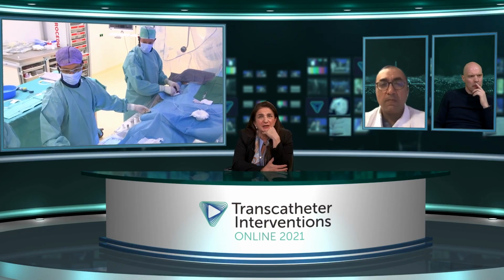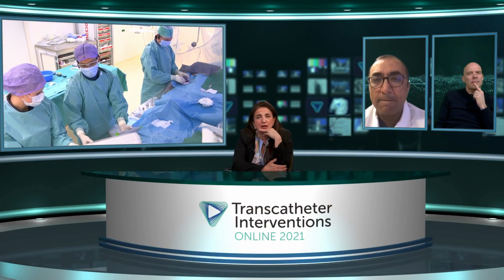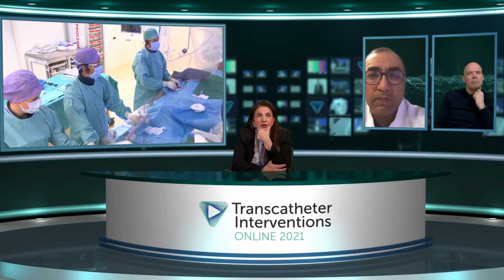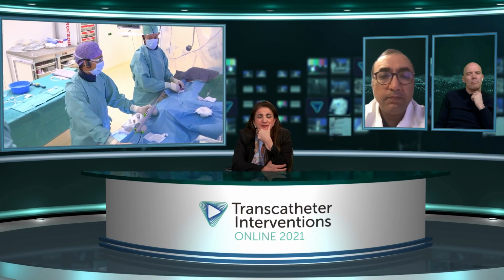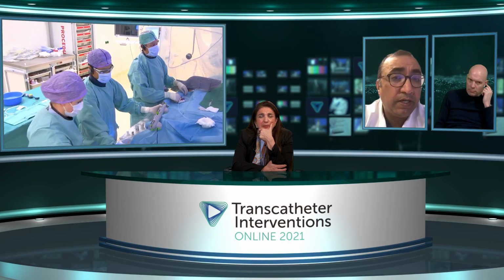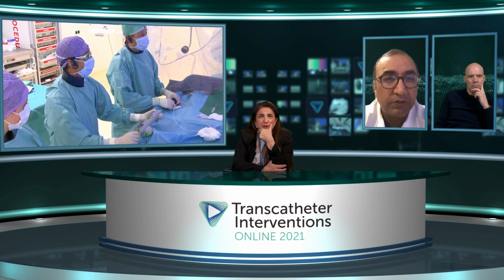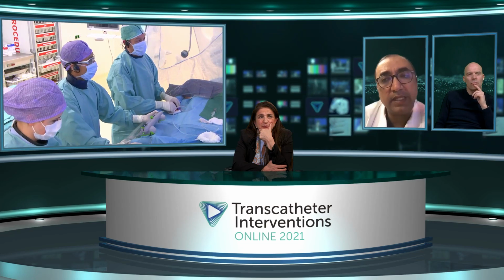The device is tremendous. I mean, it really is very simple to use. We've had it in our lab for a couple of years now, and we use it often. Azim, any comments? I think this is a great case for CSI. I think you could have also used IVL in this case, like Nicholas mentioned, but I like this case for CSI. It's a nice big vessel.